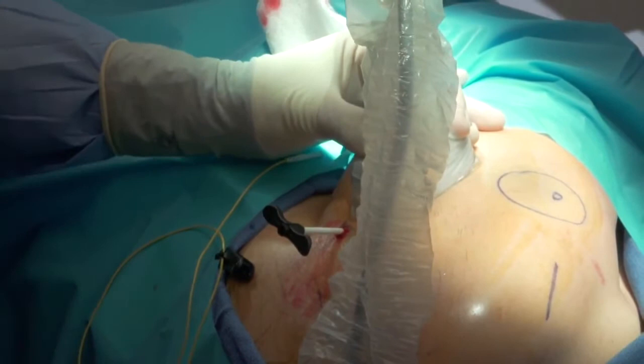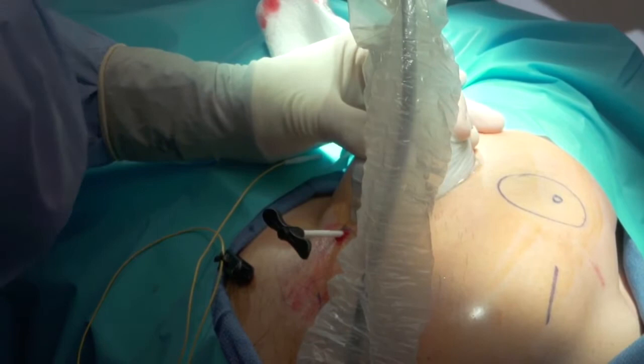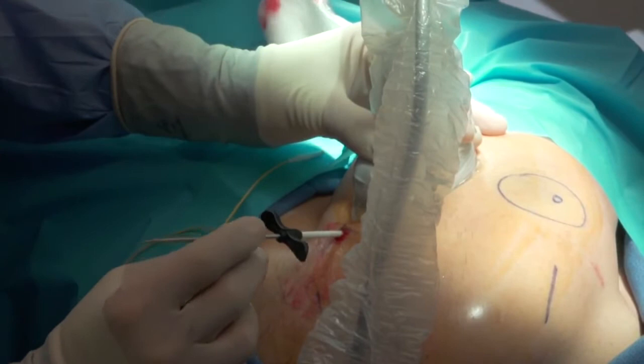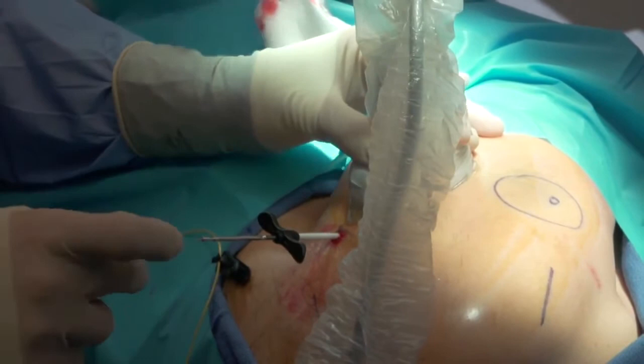And I'll take the lead. Right there. Beautiful. So again, you're getting the gist here. I place the lead in, and I'd like to see the tip of that come out, which I do right there. I'm going to stop right there and test one more time. Once the black meets the black, you want to stop right there.